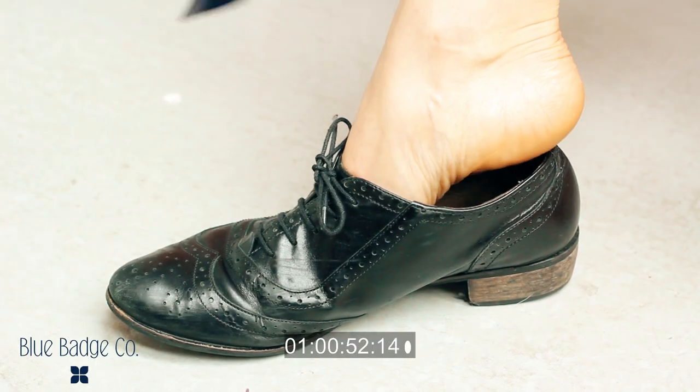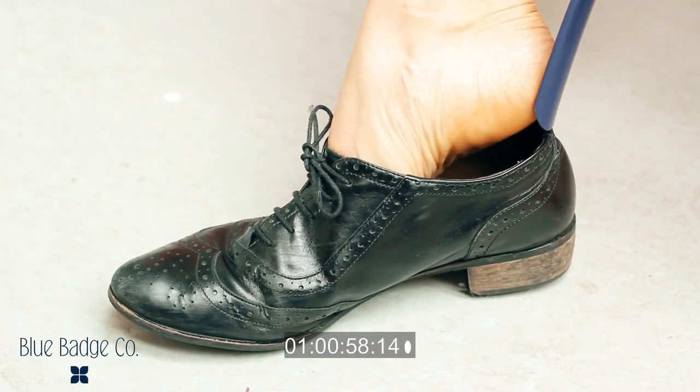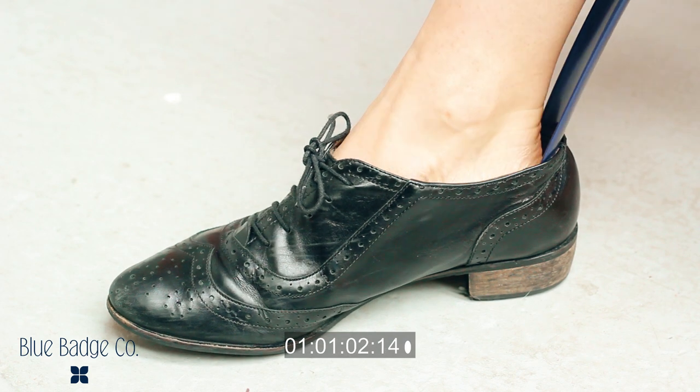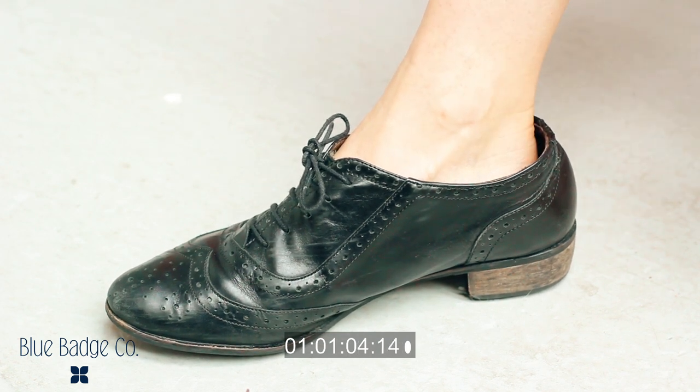Once you've got your toes slightly in, take the shoe horn out and turn it the other way round. You can now put this end into the heel of the shoe and slide your heel down into the back of the shoe horn. Then remove the shoe horn and your shoe will be nicely fitted.